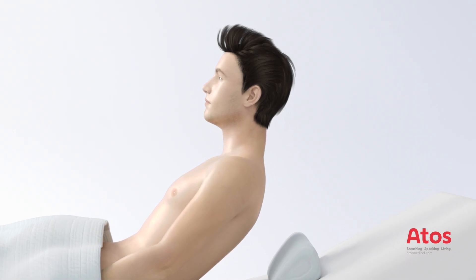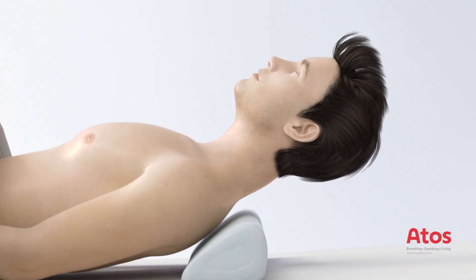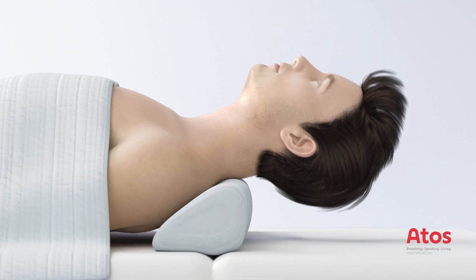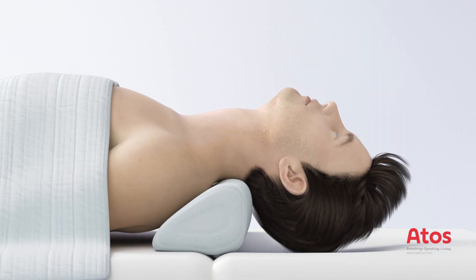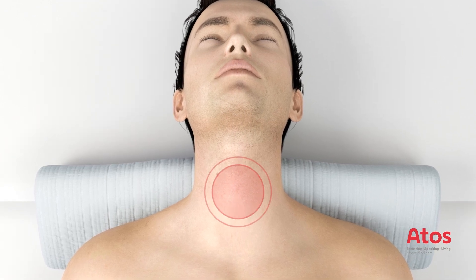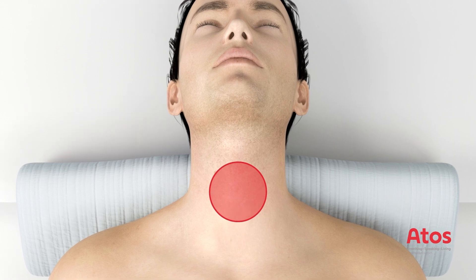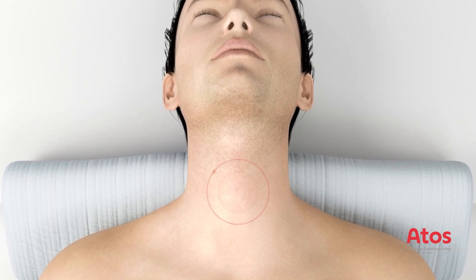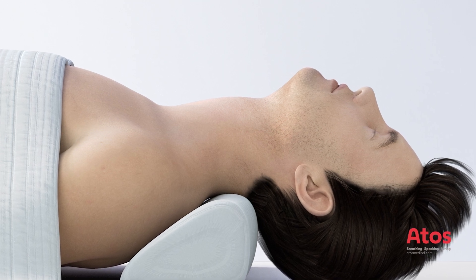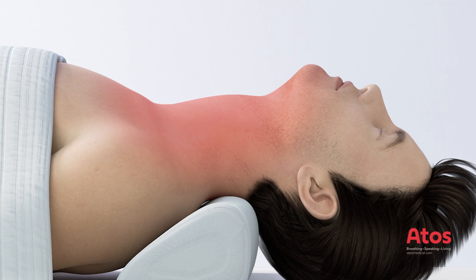Set the bed flat and position the patient supine with a roll of bedsheets or a pillow beneath the shoulders, under the neck below the base of the skull, so that the head and neck are fully extended. Stabilize the head and neck. The patient's internal and external anatomy should be examined for anatomical anomalies that may adversely affect this procedure.